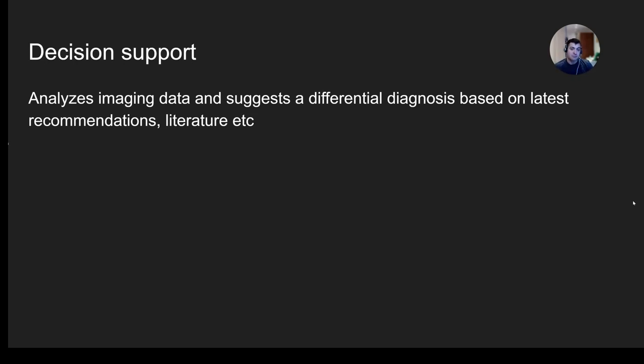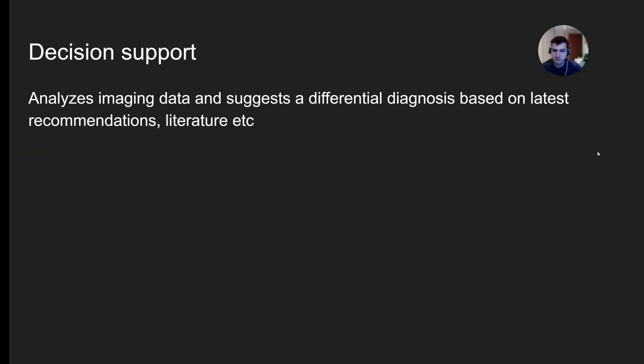And so in order to combat this, you can have an AI assistant that can analyze all that incoming data and give them the best sort of available option, give them some kind of a suggestion that they can work with. And then obviously the doctor would be the ultimate authority in deciding whether or not to use what AI has suggested. This is actually very similar to what we would see with image analysis, with my example of emergency medicine, for example.